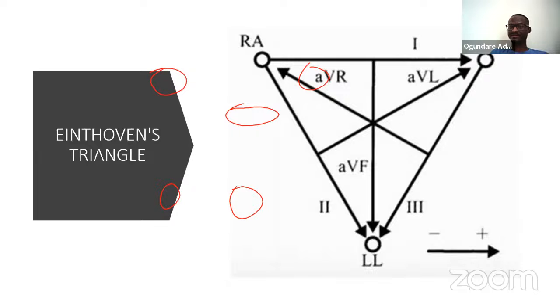It doesn't really matter. Sometimes where it matters depends on which part of the heart your attention is on, maybe the lateral, the inferior part, or the medial side, or which section of the heart you are interested in, and that would influence where you put your chest electrode. But with the 5 cable electrodes, that's it.